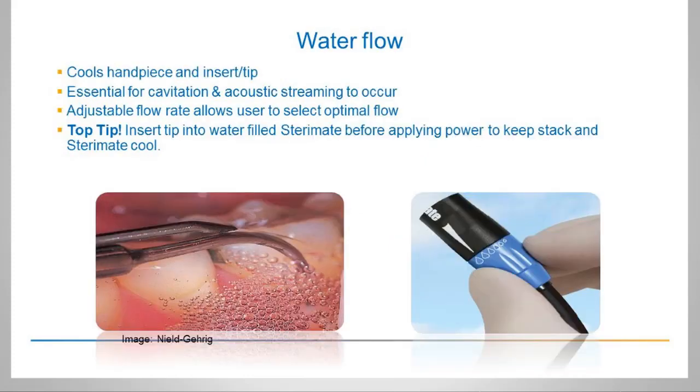And the water flow. The water flow cools the handpiece and the insert and the tip. It's essential for cavitation and acoustic streaming to occur. An adjustable flow rate allows the user to select optimal flow.